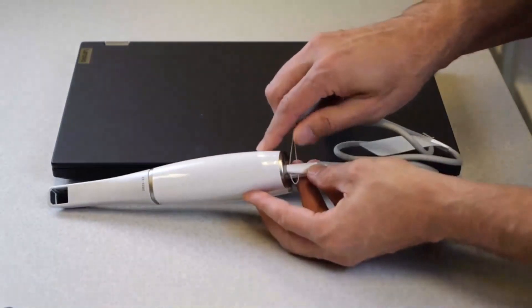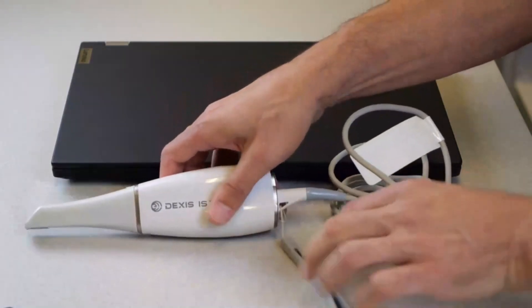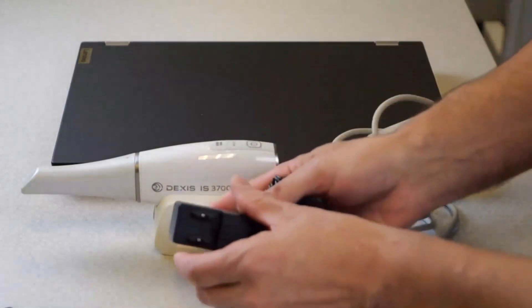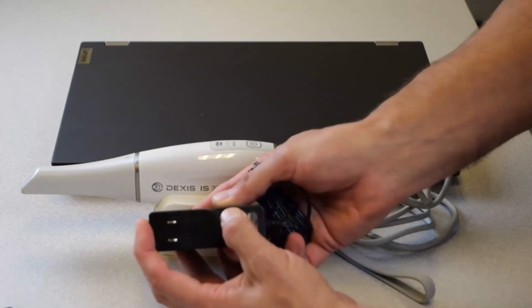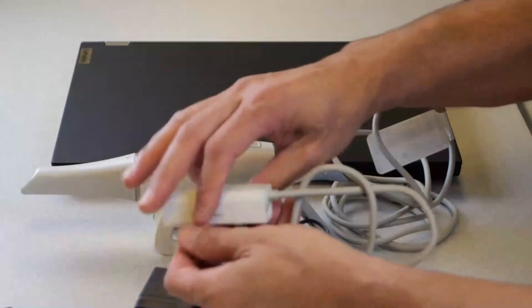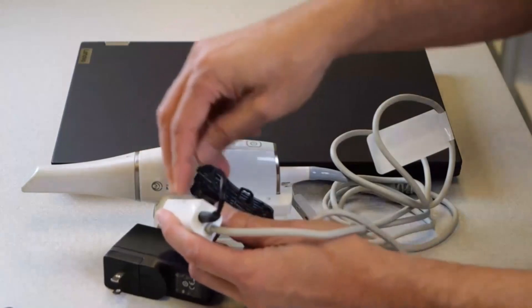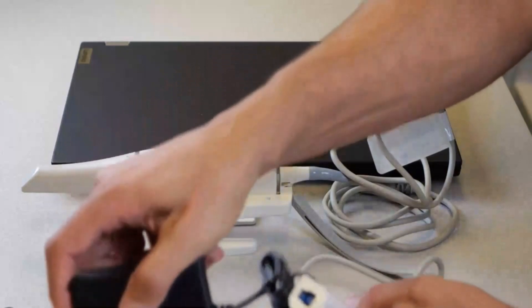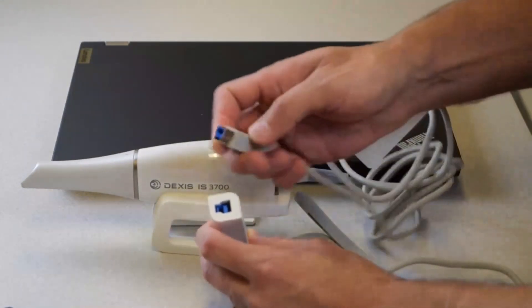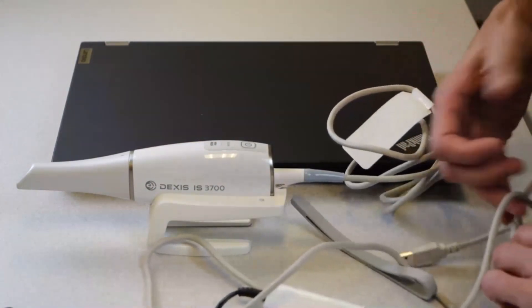Connect the wrist strap as shown. Connect the power adapter. Connect the wall outlet power cable to the power box and plug it to a power source. Connect the scanner to the power box. Plug the USB cable to the USB 3.0 port on the computer.